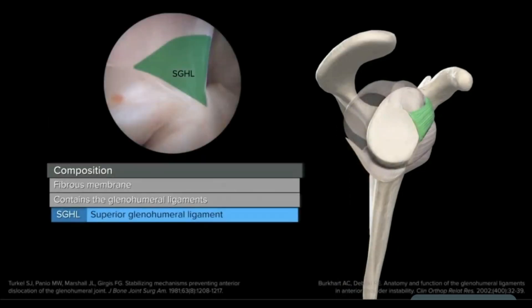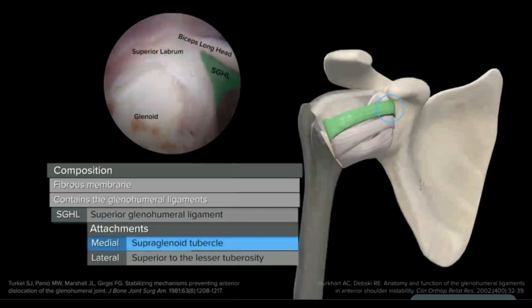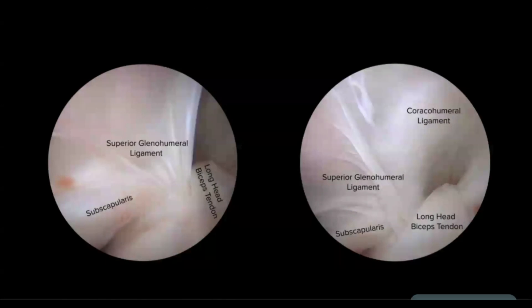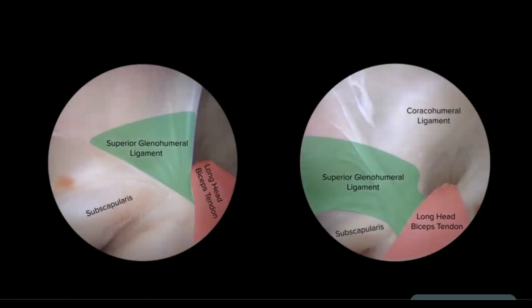The superior glenohumeral ligament, identified in this arthroscopic image of a right shoulder viewed anteriorly from a posterior portal, attaches medially at the supraglenoid tubercle and superior labrum, and laterally just superior to the lesser tuberosity of the humerus. Laterally, it makes up the bicep sling or the medial pulley, which is comprised of the superior glenohumeral ligament and the coracohumeral ligament.